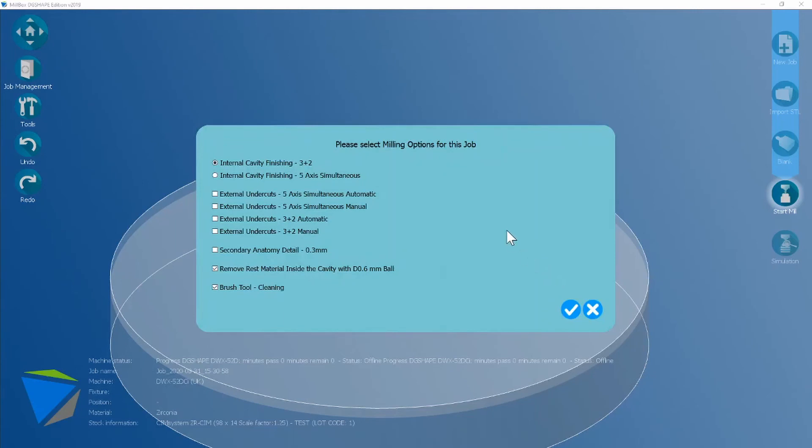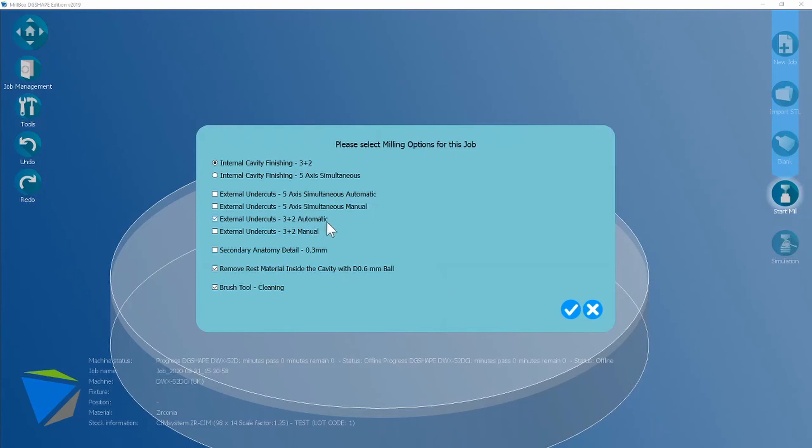Here are your milling options. Default is internal cavity 3 plus 2 and I'm going to select 3 plus 2 automatic for the external undercuts. Automatic just means the software is going to look for the undercuts within the crown. If you were going to choose manual you use a tool called select in this list over here.